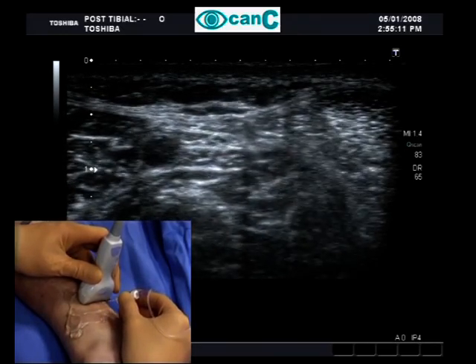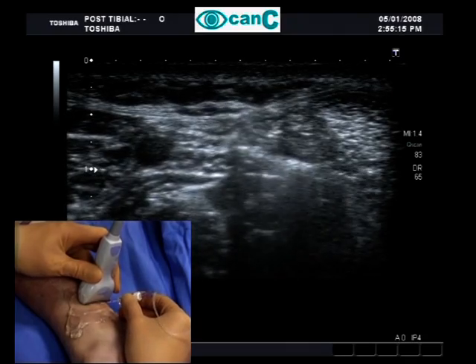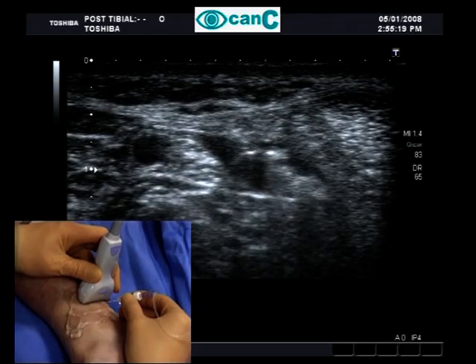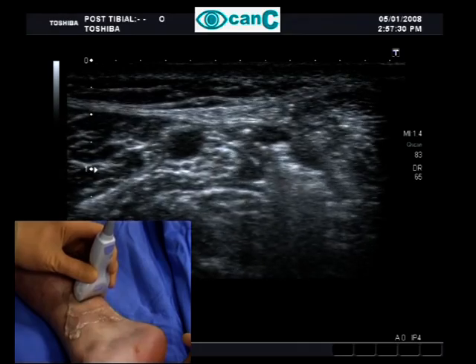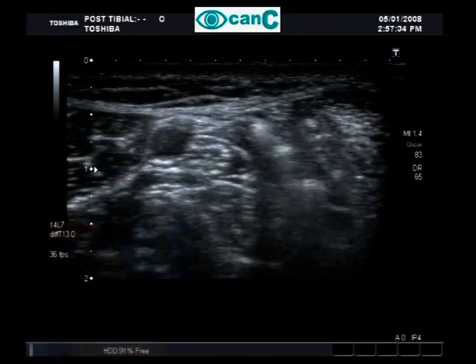Here, a small amount of air is inadvertently injected. One to two mils of local anaesthetic can be seen to spread over the nerve. Moving the probe along the long axis of the nerve confirms satisfactory spread of local anaesthetic.